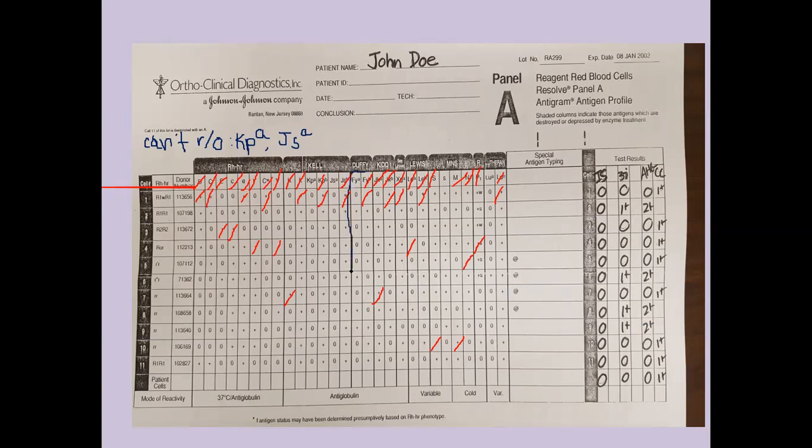So this is going to be really tricky because this is a very narrow column. Oh, I'm not doing a good job here. This is a perfect pattern match, okay? But we're still going to look at little s. And right off the bat, we see positive here with a negative. Nope. Negative here with a positive. Nope. Positive. No, it doesn't match. So this is looking like anti-Duffy A. Or was it Duffy B? I don't remember. But that's what this one is looking like.